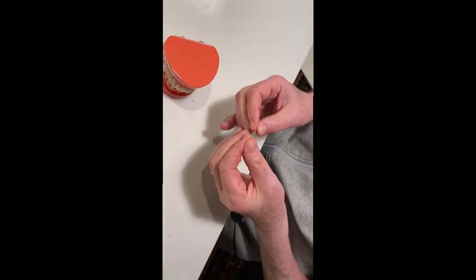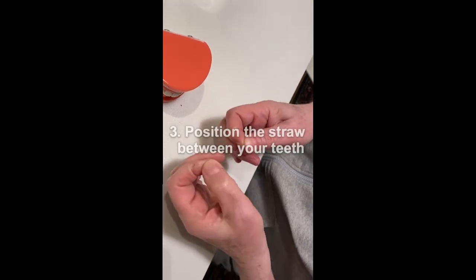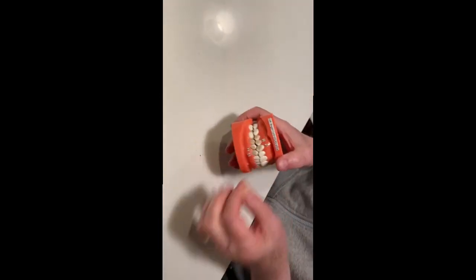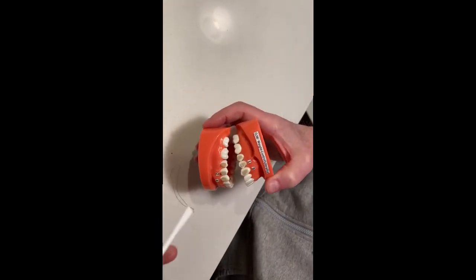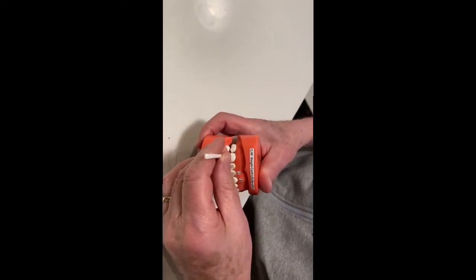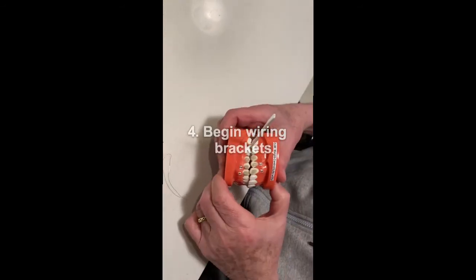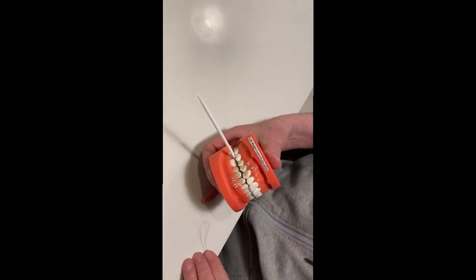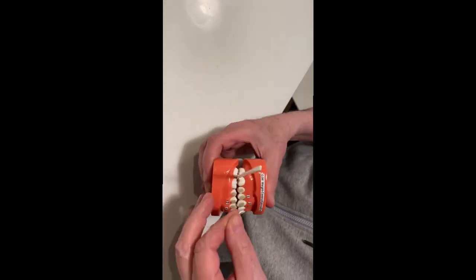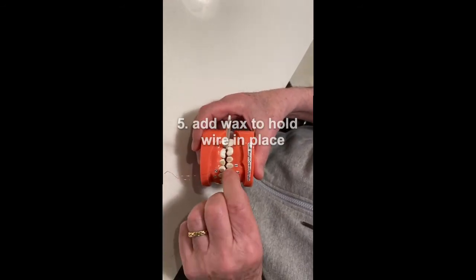Spread it apart. In your teeth, you will place the straw at approximately the distance you want your teeth to be wired into. That looks about right. Then, take your piece of wire. Put it on bracket number one. Place it into the slot of bracket number one. Tack it in with a little piece of wax.